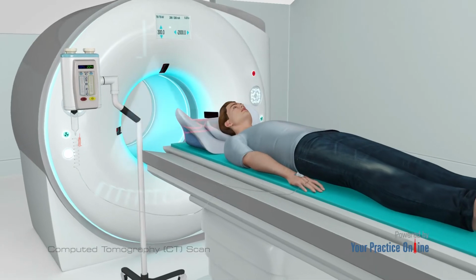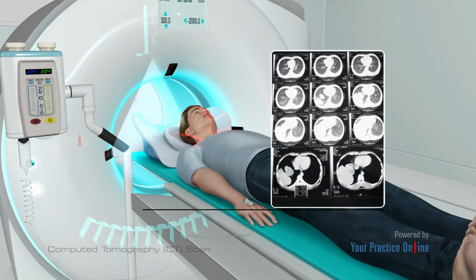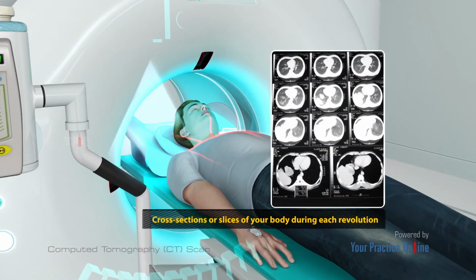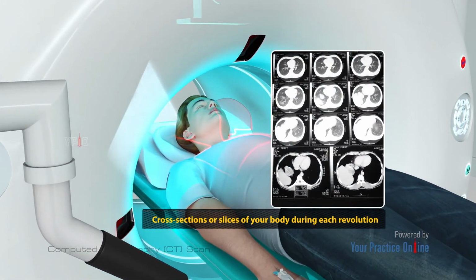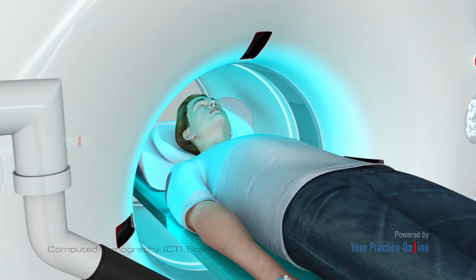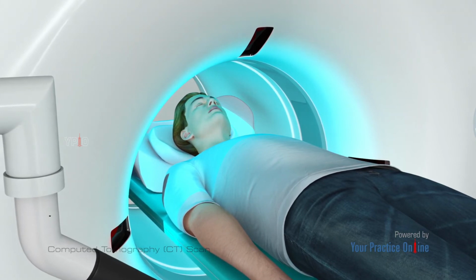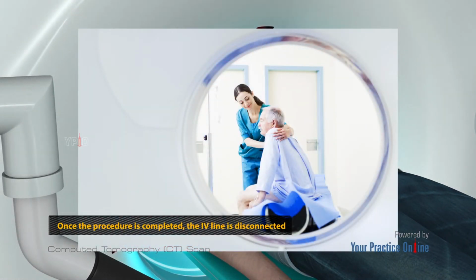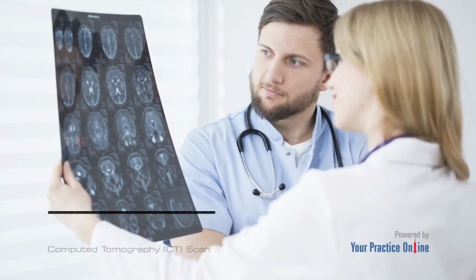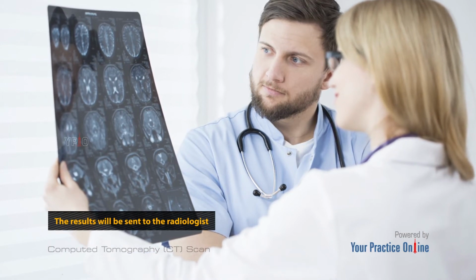As the table moves into the scanner, the detectors and X-ray tube revolve around you, forming several images of thin cross-sections or slices of your body during each revolution. There will be buzzing noises that indicate the scanner is doing its work. In some cases, you may be asked to hold your breath for a few seconds during the image capturing process. Once the procedure is completed, the IV line is disconnected and you are allowed to go home. The results will be sent to the radiologist to read and a report sent to your doctor to discuss with you.